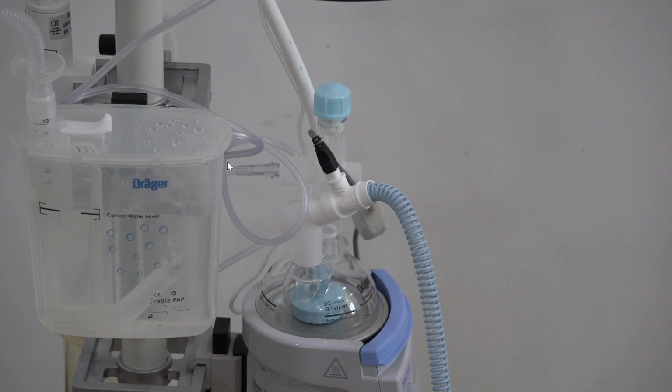Okay, another very interesting question. How will you measure the accuracy of the CPAP level delivered to the patient and the bubble device set pressure? Linda, would you like to say something about it? I think you must deal with it, Marguerite, because for me, the big thing is, what does the blood gas look like? What does the baby look like? Are we able to wean the baby? That would be important, and as you've explained how the whole system works.